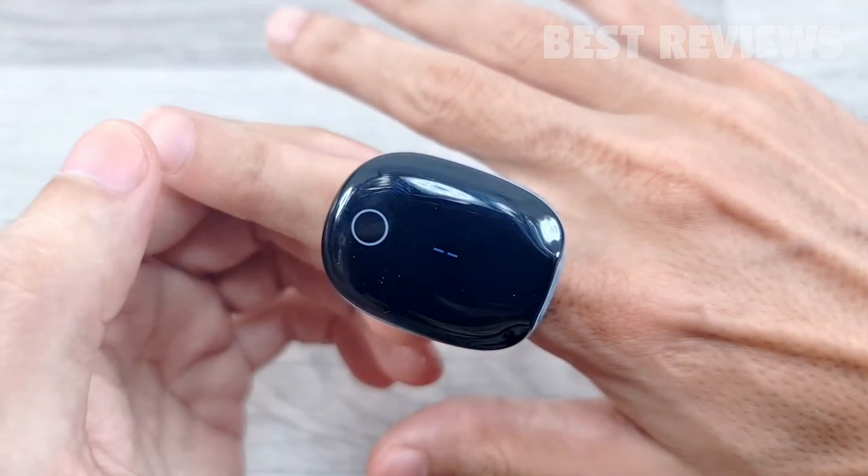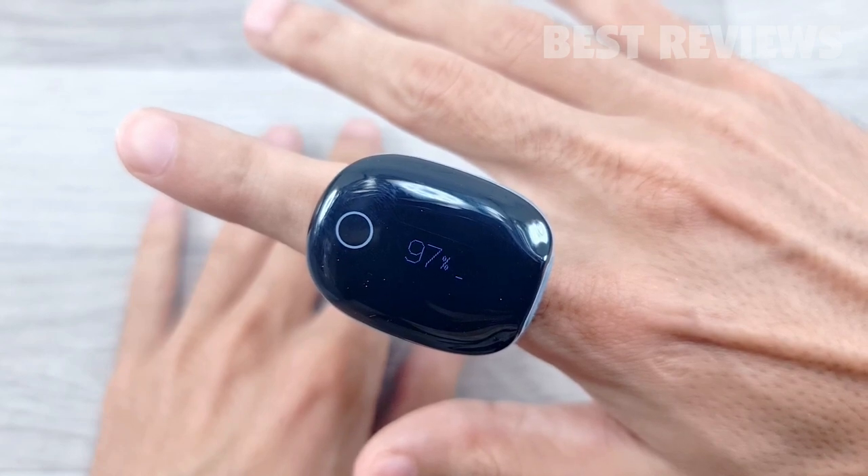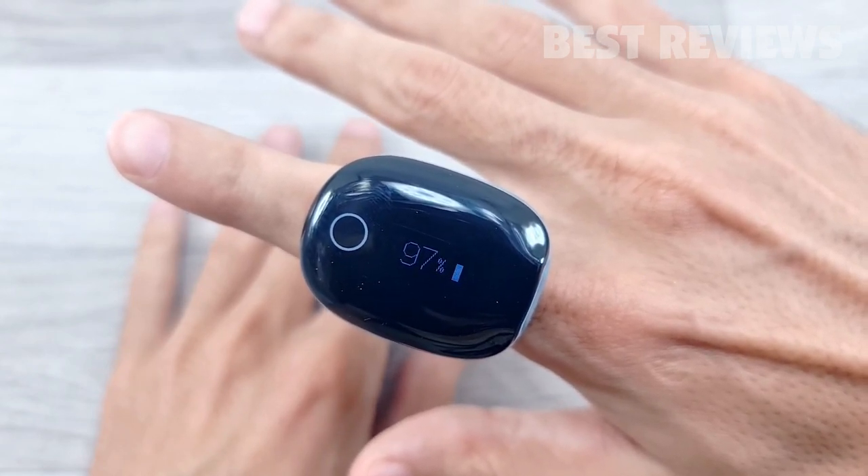When low oxygen level or abnormal heart rate is detected, it silently vibrates, waking you up, alerting you to breathing interruptions during the night.